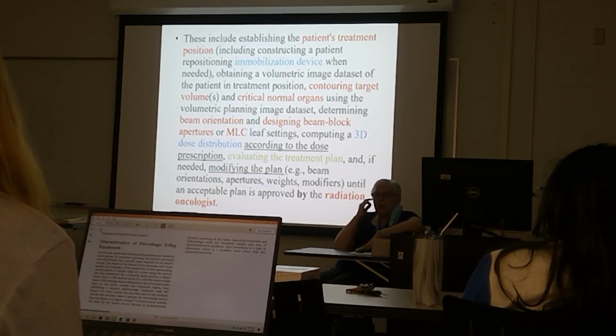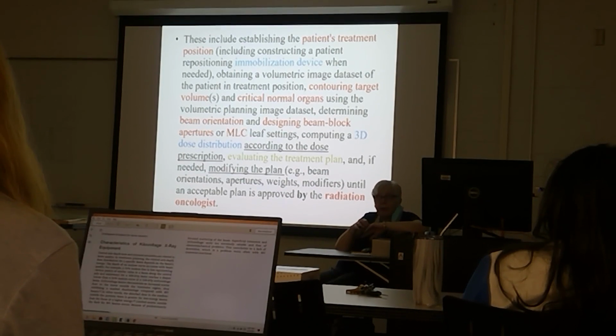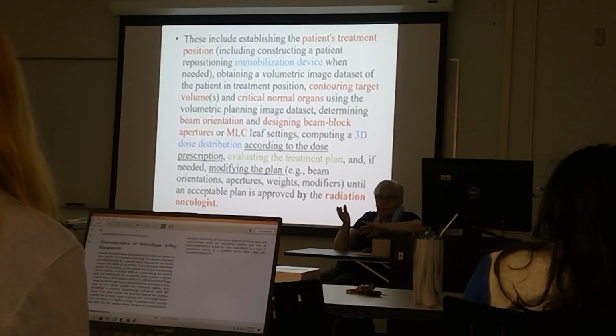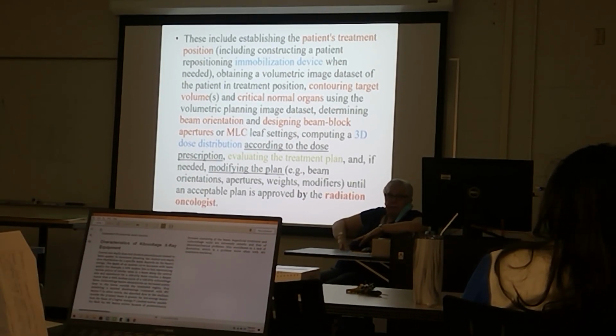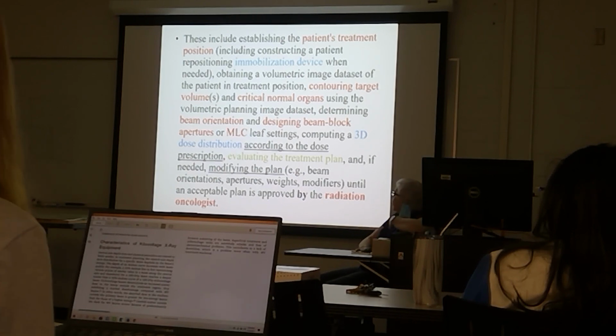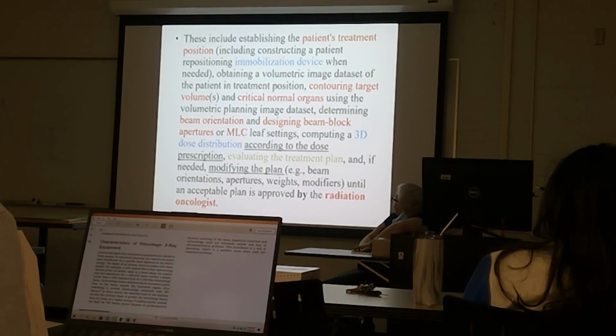The small bowel usually is only contoured if we're treating the nodes as well as the prostate, so we'll be treating a fairly large area. So the dosimetrist will do that usually. He may, just for the heck of it, contour the kidneys if they've scanned high enough, just in case. So critical normal structures.